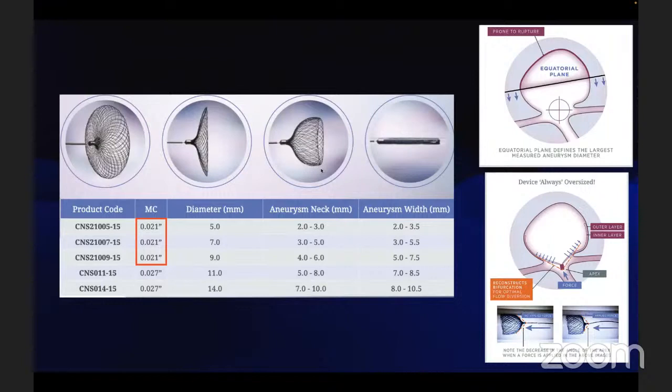So you oversize it. Yeah, sir. So that it snugly fits the side walls of the aneurysm, so that it prevents the reversal of this contour system, sir.